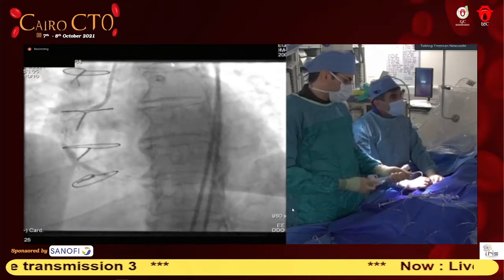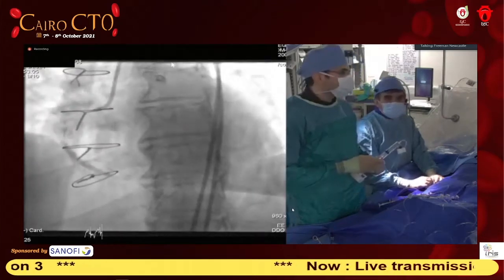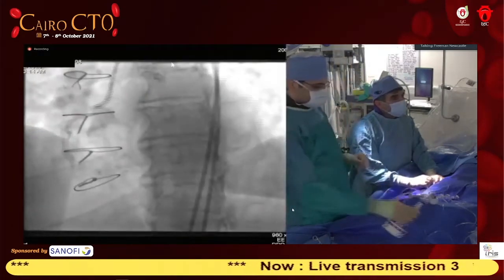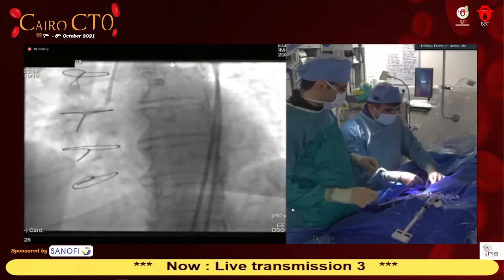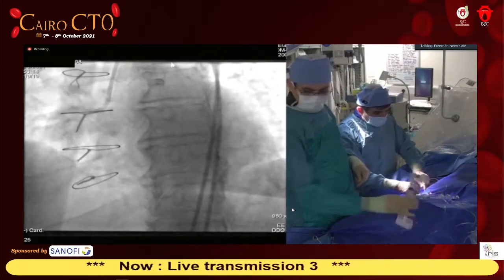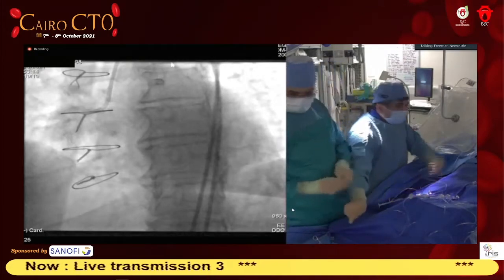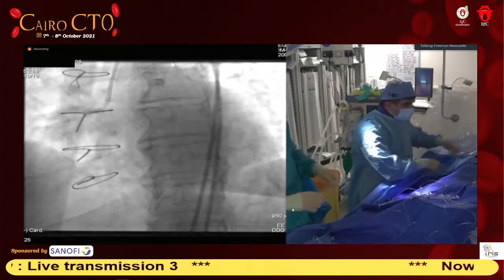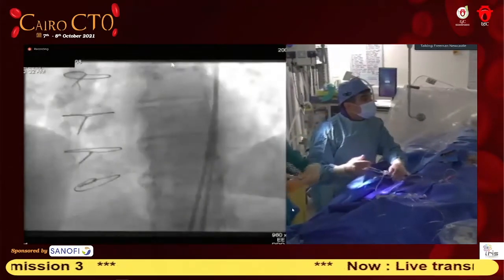Store and down. If you notice that we hardly take any cine during these CTOs, storing fluoro would do that same trick. You reduce your radiation by a huge amount, and you save yourself radiation exposure as well as the staff and the patient. And you probably noticed that we have, can you see this, it's called the rad pad again to protect me from the radiation coming from the scatter from the patient.